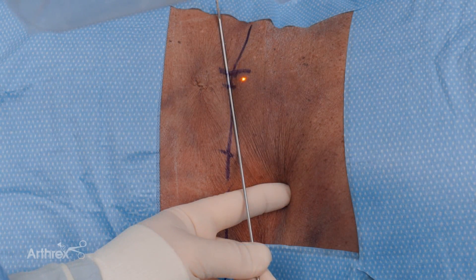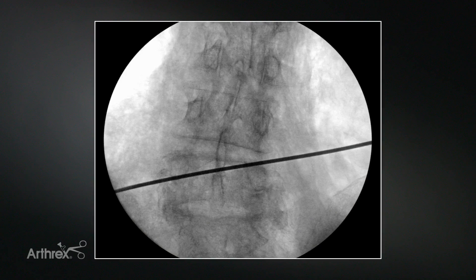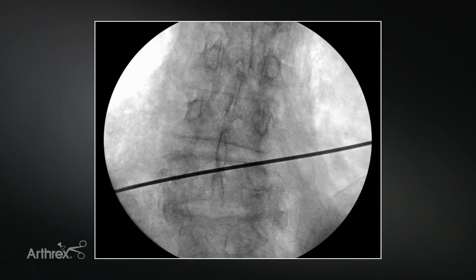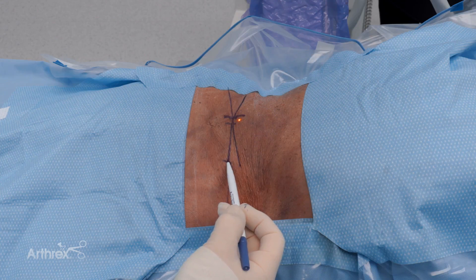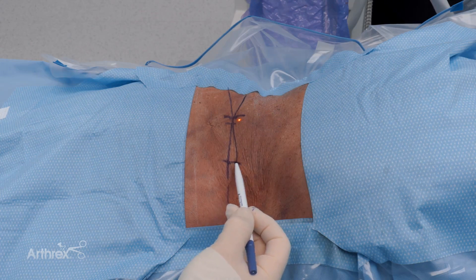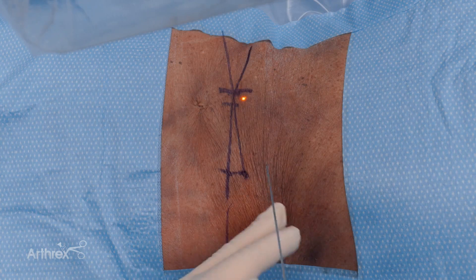This line that marks from the caudal end of the contralateral pedicle to the top of the ipsilateral pedicle is a good rule of thumb to determine your best trajectory for the contained herniation or one that's localized into the lateral recess. This allows you to avoid the exiting nerve root and dorsal root ganglion and get more medial on your approach to the lateral recess, yet still have good access to the disc to at least the midline. This distance drawn up to that trajectory is where you're going to insert the needle.